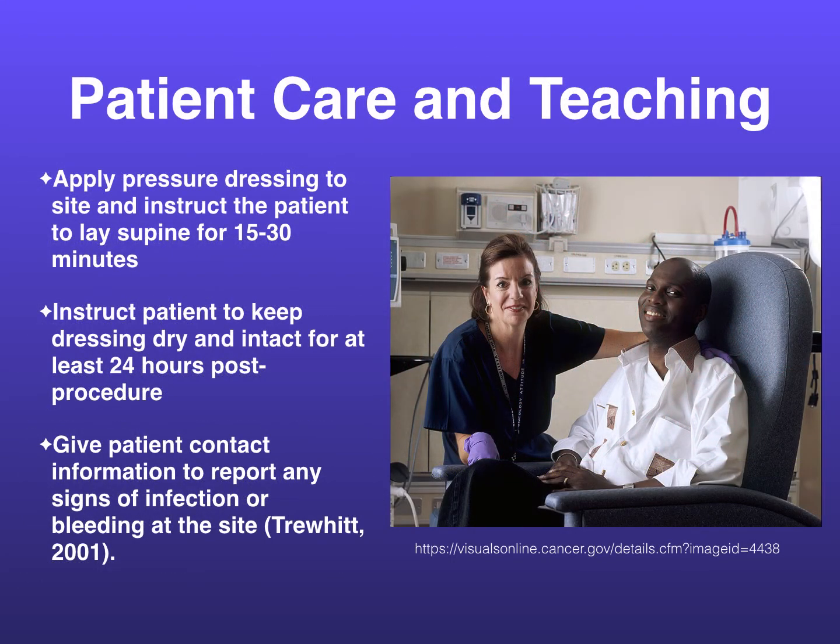So once all the specimens have been collected, you're going to continue to apply pressure to the site until the bleeding has stopped, and then apply a pressure dressing to the site and instruct the patient to lay supine for 15 to 30 minutes before they are discharged.